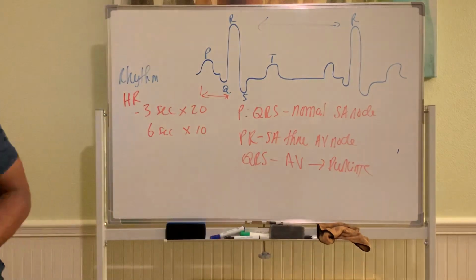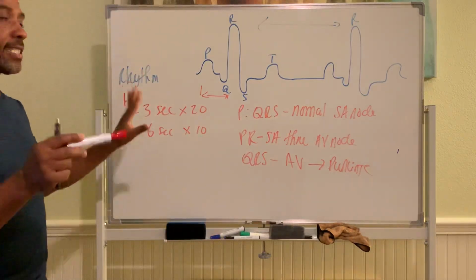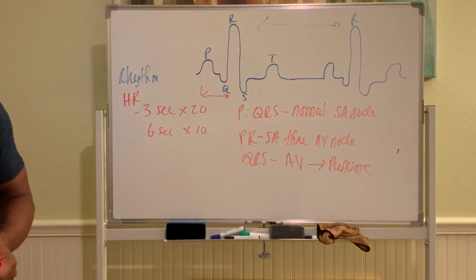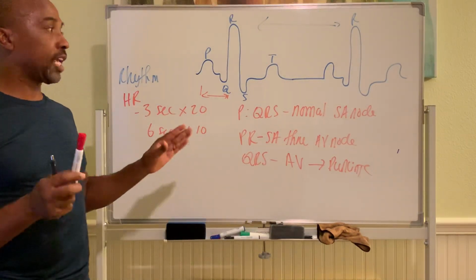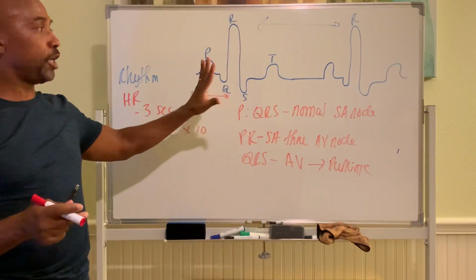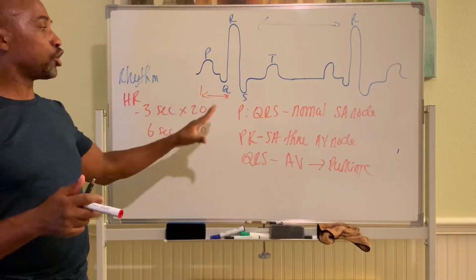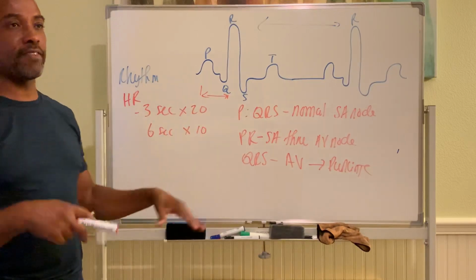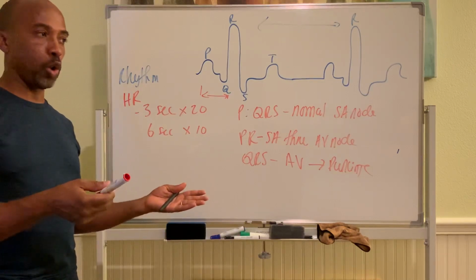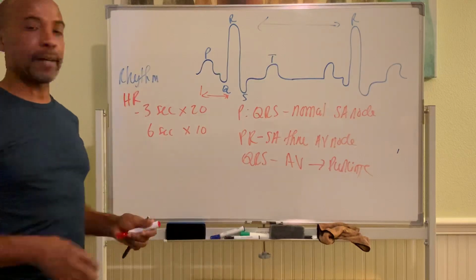All right, so we're gonna do before exercise, after exercise, measure these things and assess them. I think the table required, okay? And on your lab quiz, I will give you the same strips and have you assess the strips for different things. So be able to look at the EKG, label things, and measure different intervals on it. And have an idea of what is going on with EKG as it changes from, say, normal to when it becomes abnormal. Okay, so that's the EKG lab.